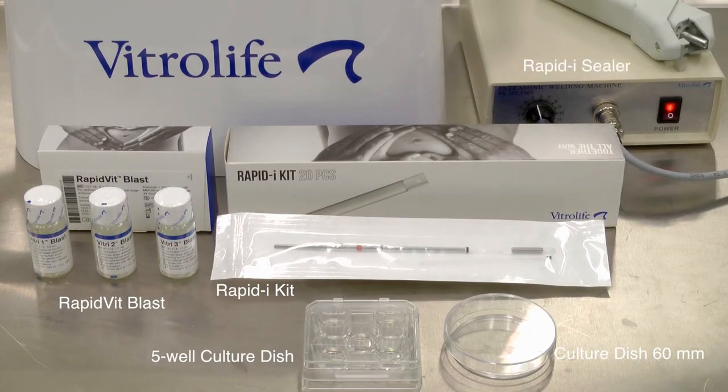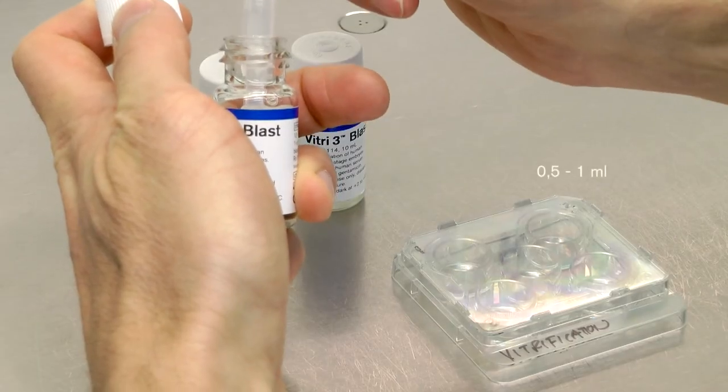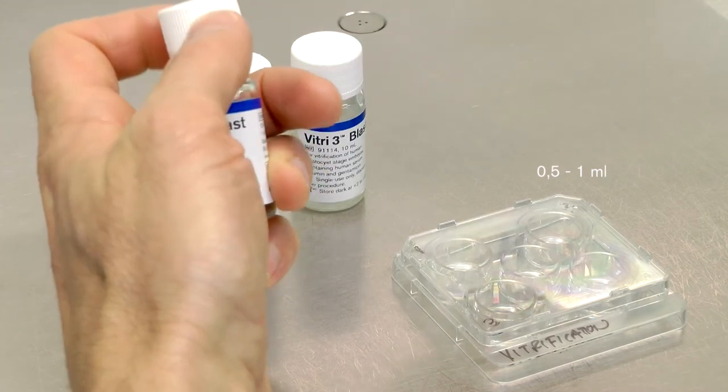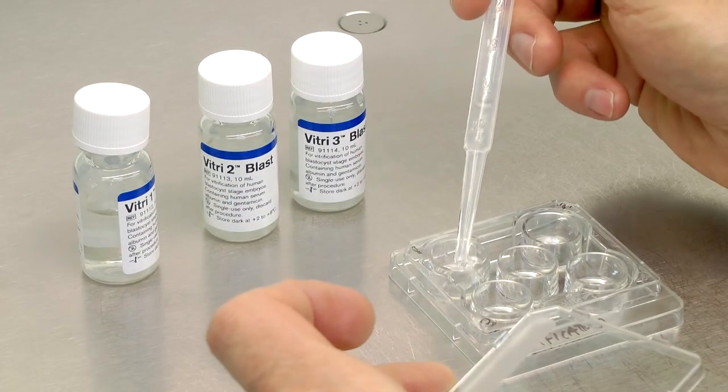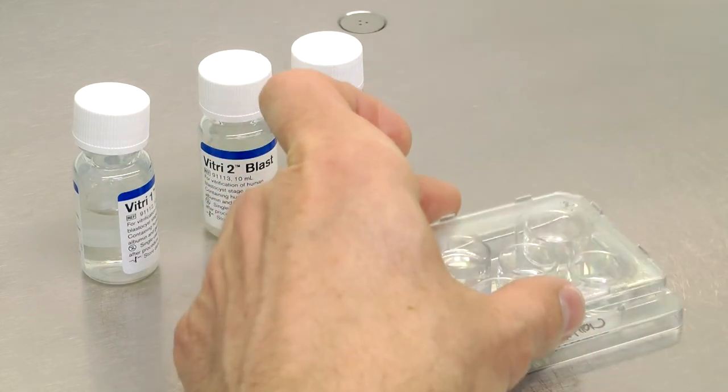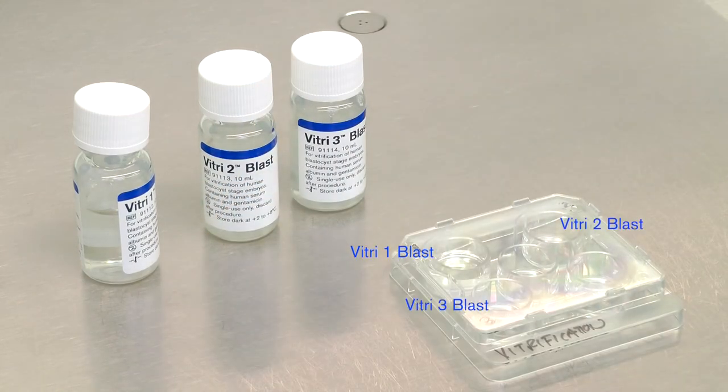The ultrasonic RapidEye sealer and the smart box containing liquid nitrogen. Place between 0.5 and 1 ml of each of the vitrification solutions in separate wells of the 5-well dish. Place the lid on and heat to 37 degrees Celsius. Do not heat the vitrification solutions in a CO2 incubator.